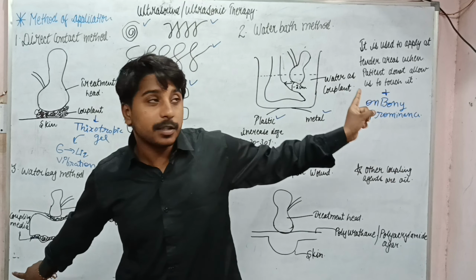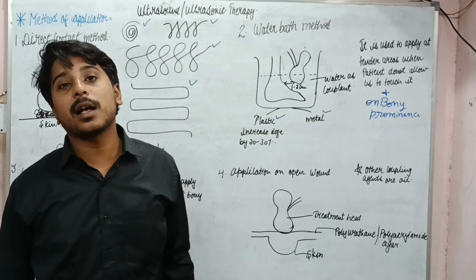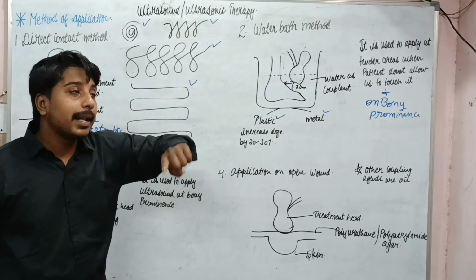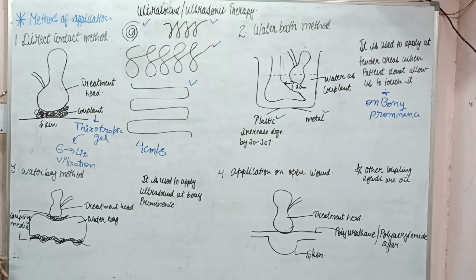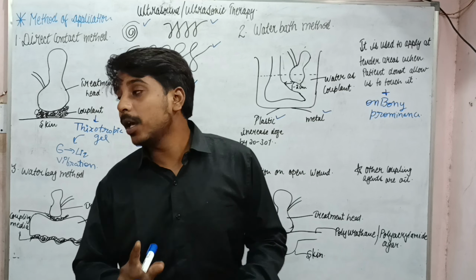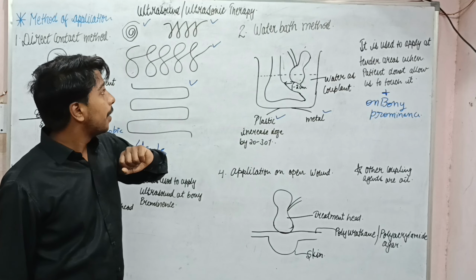But what is the difference between these two, water bag and water bath? In the water bath method, we are not touching the transducer head to the skin. So where there is a lot of tenderness and it is a bony prominence, there we can use the water bath method. And where the site of application is bony but tenderness is less, then we are using the water bag method.